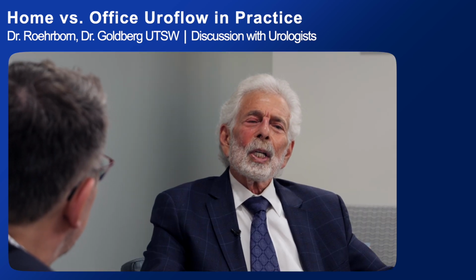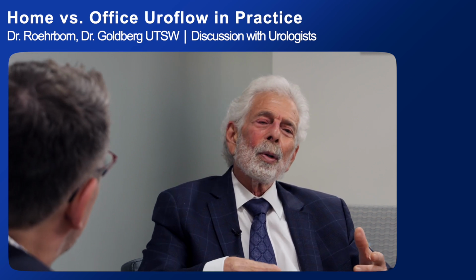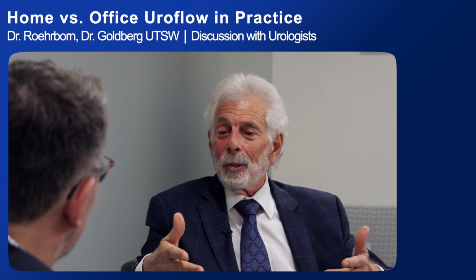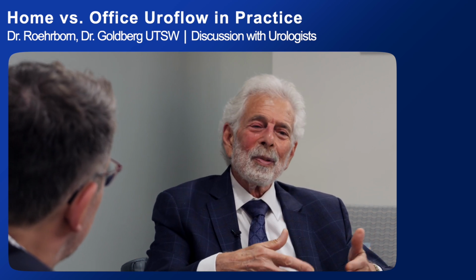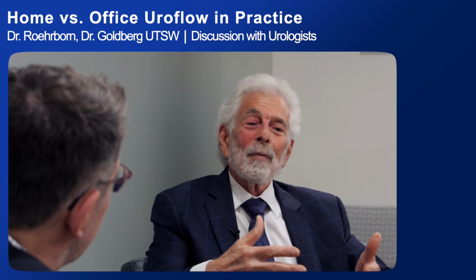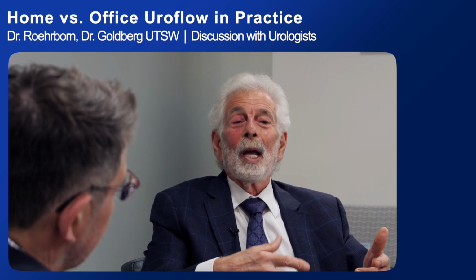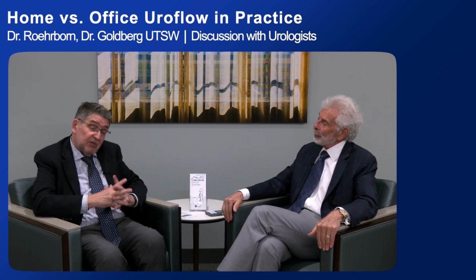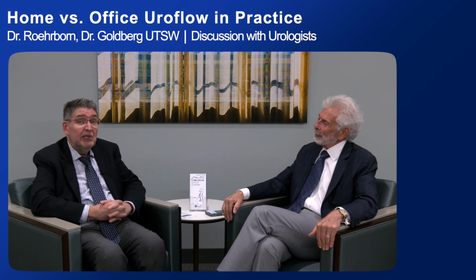It does, and I think in this era where we're learning that it's important to get the size of a prostate, whether by ultrasound or by MR, we find many of these jumbo prostates, 100, 125 grams. Men deny symptoms, PVRs maybe in the 50, 60 range. Oh, my flow rate's fine, but you start seeing his flow, and in fact, he's voiding under 10 consistently. And certainly that raises a whole question. We haven't thought we would treat asymptomatic large prostates, but maybe we need to. So sounds intriguing, noting how many patients with BPH we treat.